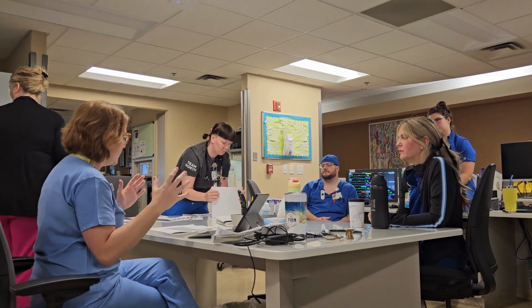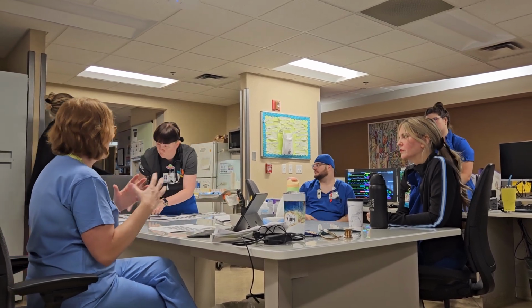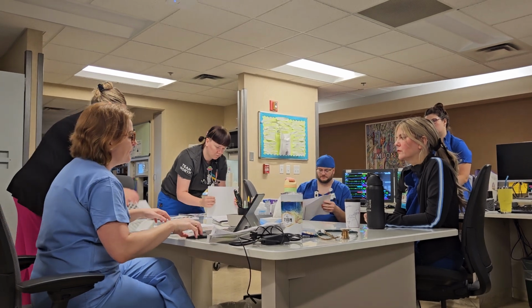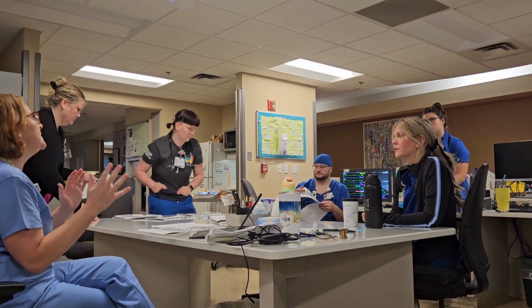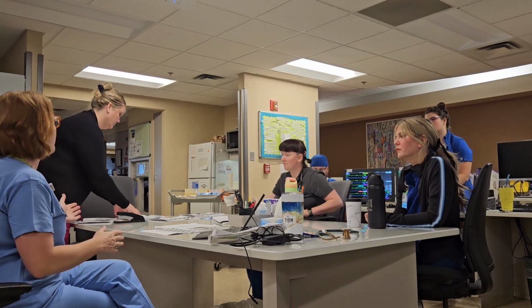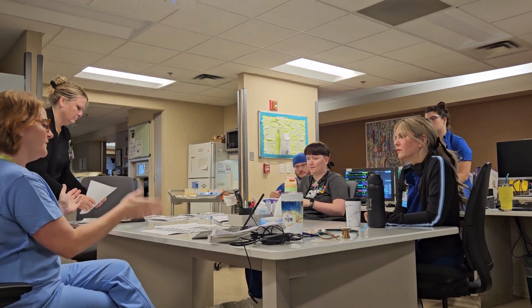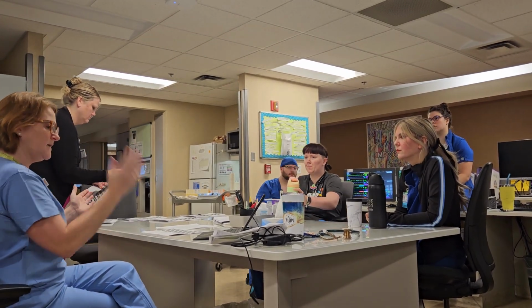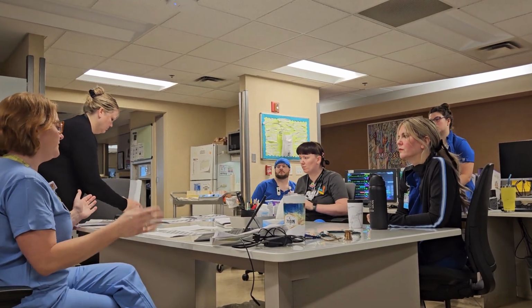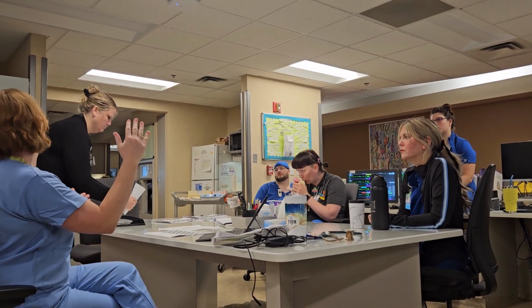So that's based largely on the patient's lung compliance, which we do talk about a little bit in the next slide. But if a patient on AC tries to initiate a breath, AC will say, oh, you want to take a breath. I'm giving you 450 every 12 times a minute. So every 5 seconds, I'm giving you 450. You want to take a breath, I'm going to give you 450.